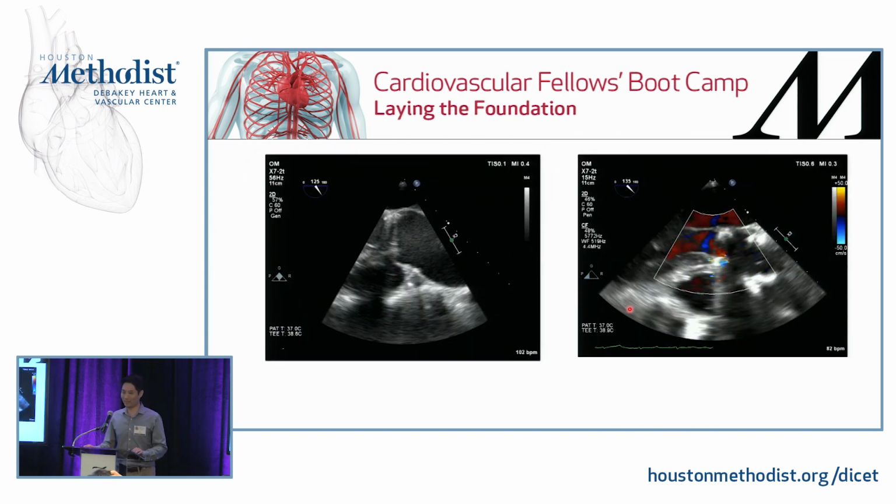Okay, so this is a real case that I did. This is a patient that had a mechanical valve that was placed a while back. Came back because had a diagnosis of an ascending aneurysm. So the surgeon asked us, is this valve okay? Do I need to do anything with it? So we put down the echo, we get our views. So there is, obviously this is abnormal, right? This ascending aneurysm looks big. So we'll look at the valve and tell him if we think that he needs to do something about it. So we'll look at it.